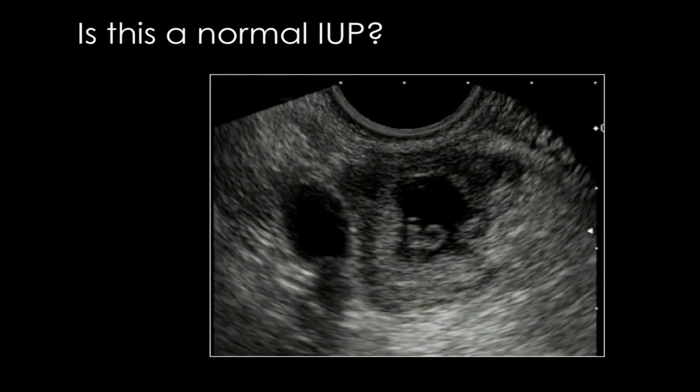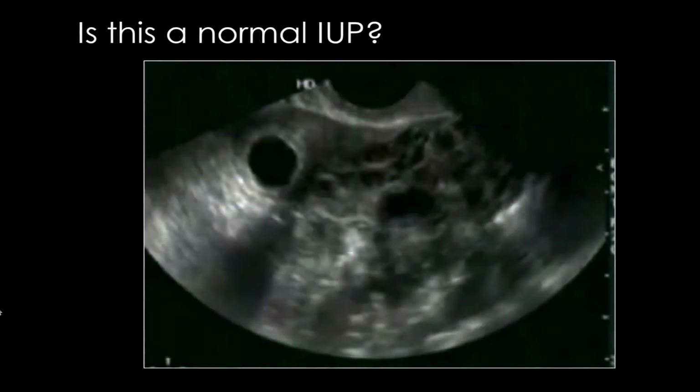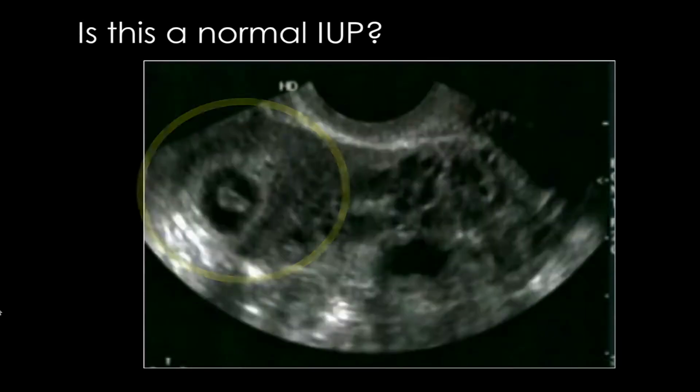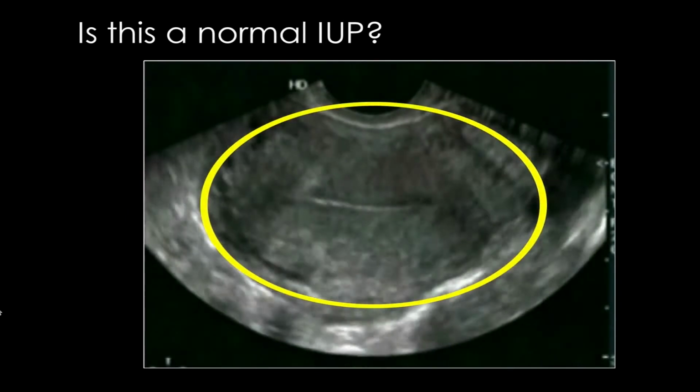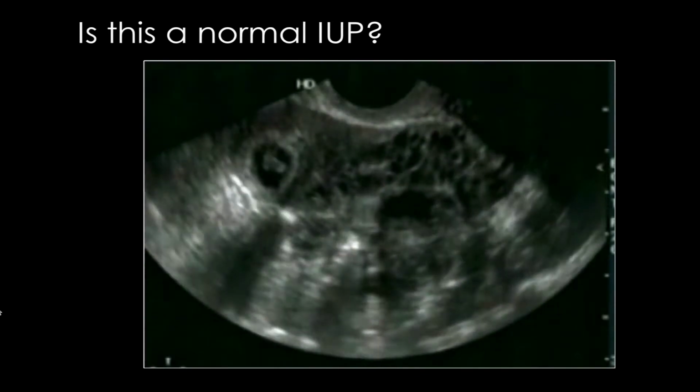The most common mistake seen when misdiagnosing ectopic pregnancy as a normal intrauterine pregnancy is to overlook that the pregnancy is not located in the uterus. Edema can cause the fallopian tube to swell and fool the examiner that an intrauterine pregnancy is present. This image is an example of just such an ectopic pregnancy that fooled the examiner. In this video, the patient appears to have an intrauterine pregnancy at first, but when you scan through the entire abdomen, you can see that the pregnancy is extrauterine.